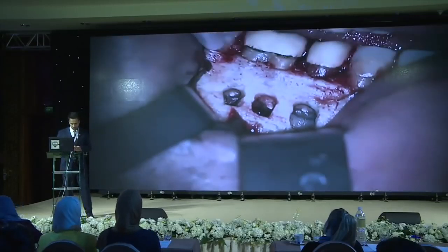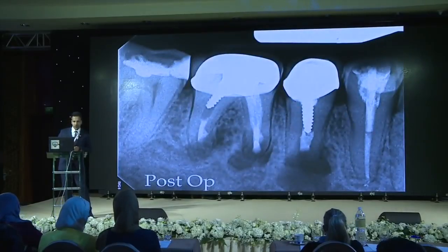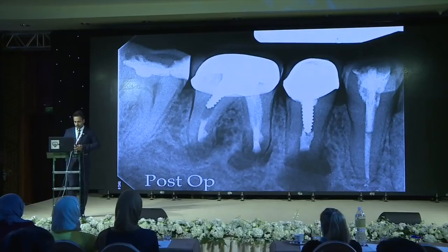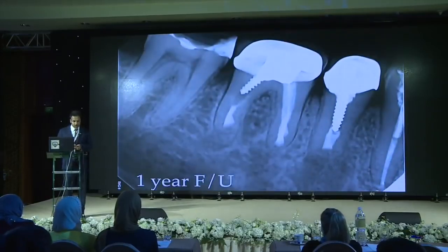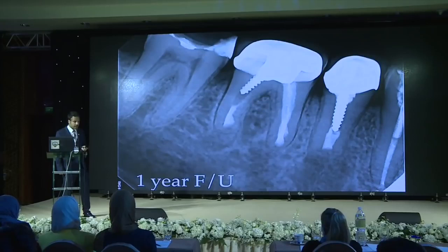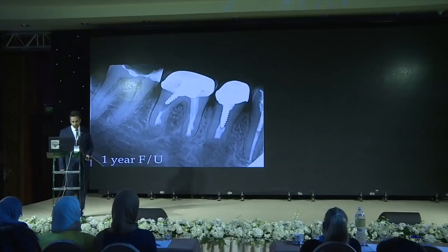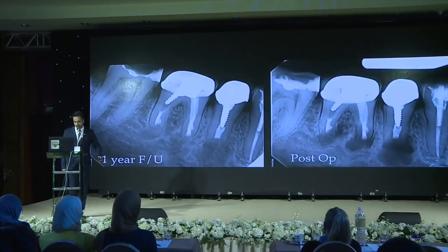Now, this is the post-op radiograph. And I saw the patient a year later, and there is a complete bone healing around the roots. And you can trace the PDL around each root of these. So comparing the post-op with the 1-year follow-up, you can see the difference.